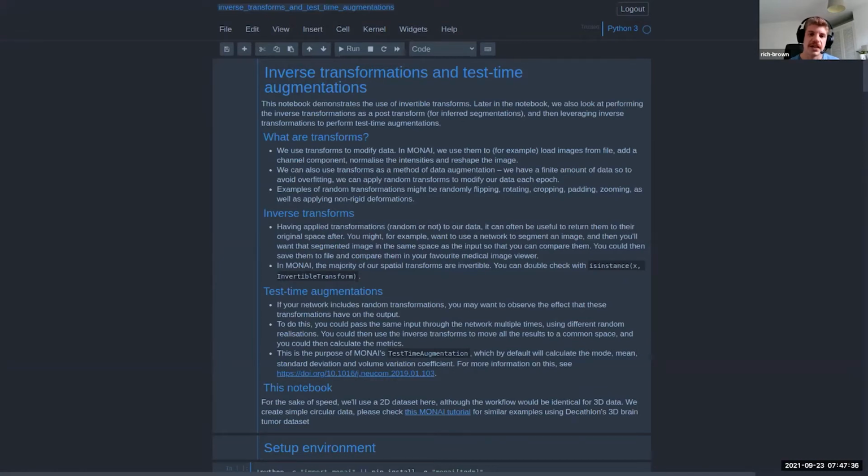So there's the data processing that goes into it. And then, as I'm sure you all know, there are the data augmentations, which we'll typically apply. This can help increase the variability in our data. And so if we have a limited data set, it can help reduce overfitting of our model.